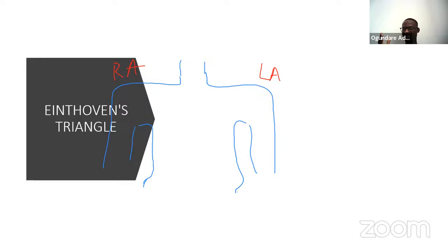What that means is it's really not doing anything. So literally, we're actually using 9 electrodes to generate the 12 leads. So the right leg is a neutral electrode.